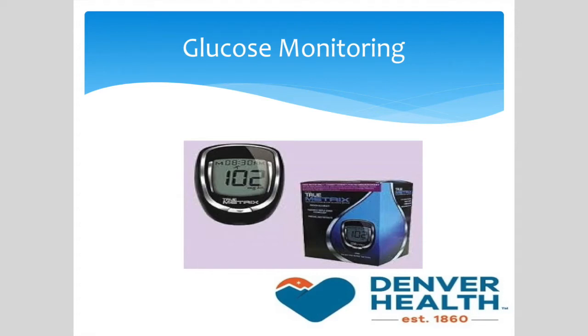Today, we will be talking about blood glucose monitoring and also be demonstrating the proper technique for checking blood sugar levels at home.